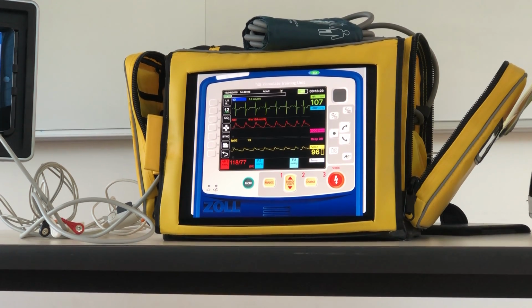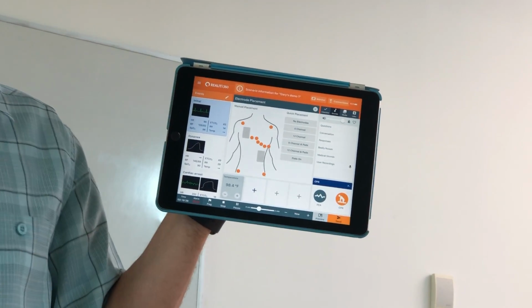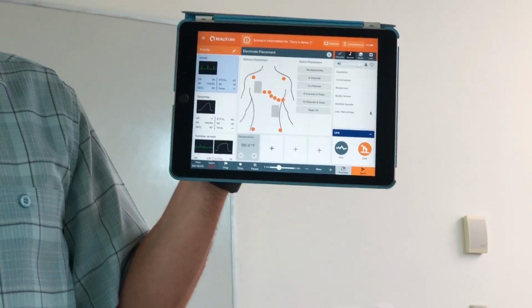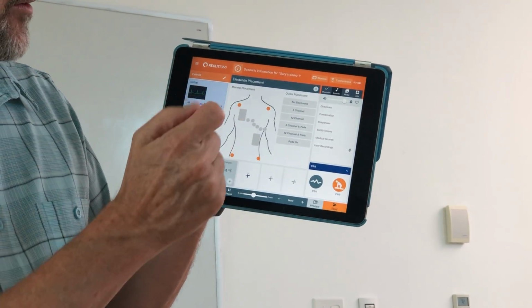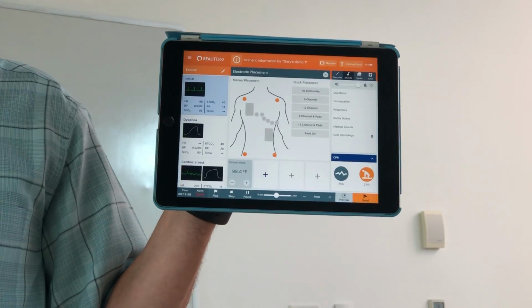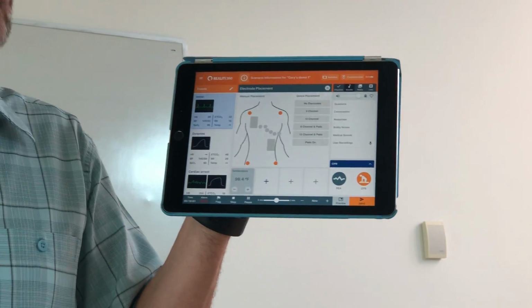There's a 12 lead button where you can go in and click and indicate which leads they're using. So you can also turn on or off the pads to show that they haven't hooked up pads yet, so pads aren't an option. If they're trying to do a 12 lead and they haven't hooked up the chest leads yet, if you go in and turn off all those chest leads, then when they turn on 12 lead, it won't give them anything except the quick 6 that they would get from the 4 lead. They won't get the chest leads, which would be a nice prompt that they need to hook up more leads before they're going to see the rest of the picture.